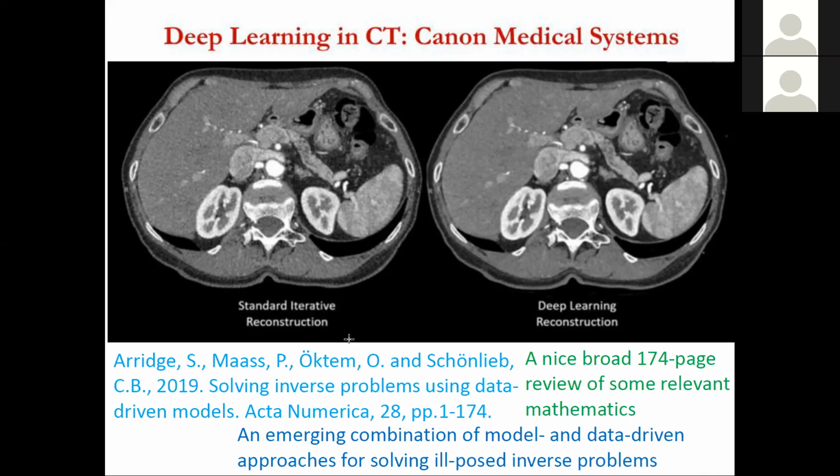No, sort of the reverse. The deep learning ones have succeeded in popular mind, or people using it, at overcoming that. In other words, the model-based were looking unnatural, didn't have the texture that people were familiar with. So the deep learning is intentionally, certainly for CT, reproducing the classic look of a high-dose image by pairing it with a high-dose image.